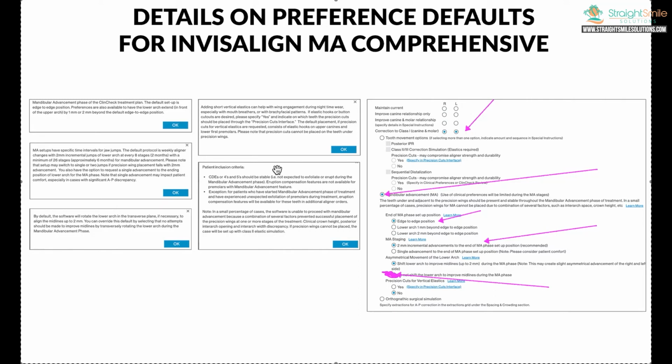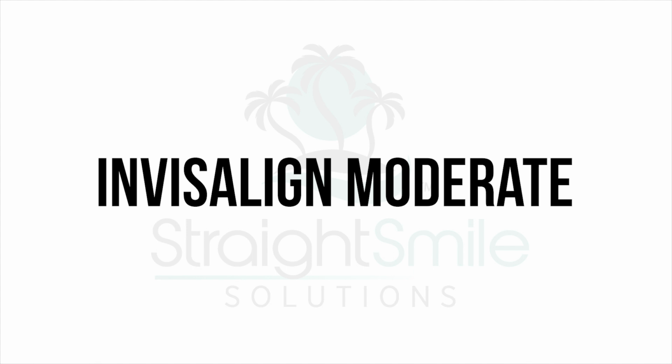I mean, if you didn't tackle it, it's just another reason, benefit to support doing phase 1 treatment. I mean, you really should have tackled this in phase 1, but I think it's a good value. If you've still got a growing patient and most of their teeth are in, I think it's a good value to spend $1,870 on a lab fee and do it all in one go. If I had a growing boy that had all their teeth in, I'd do it, with an overjet. So, I would love to definitely see some cases if any of you out there have finished one and you do not work for Align and you're not a lecturer for them.